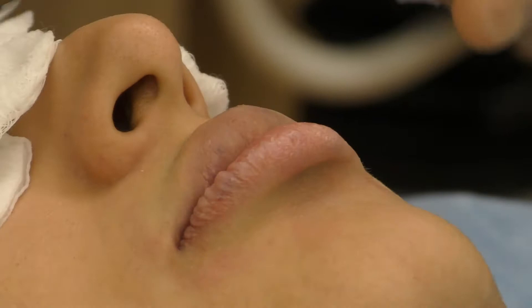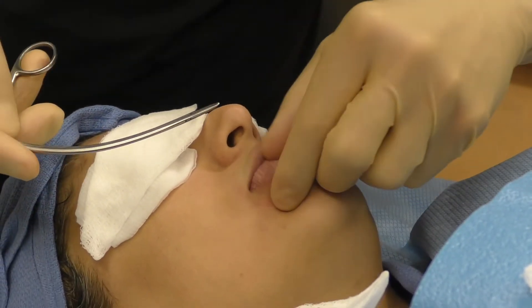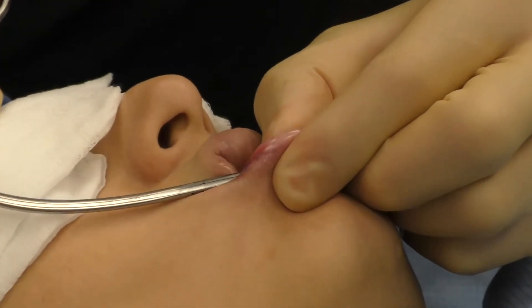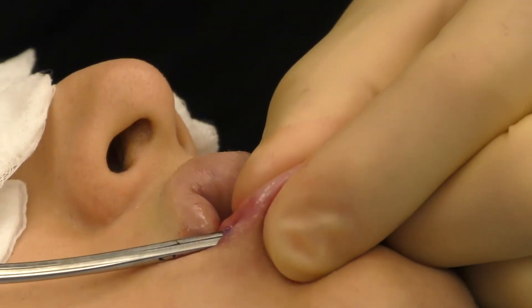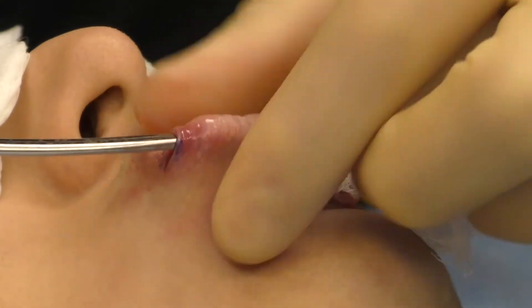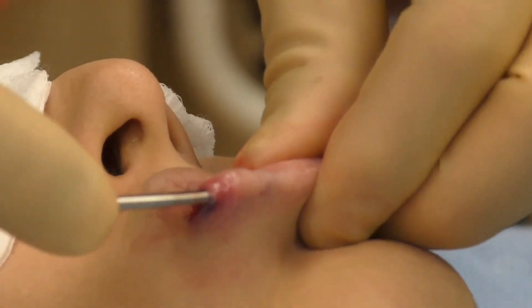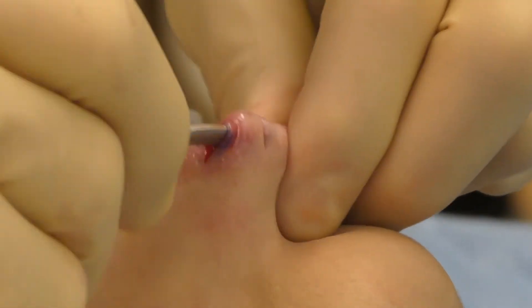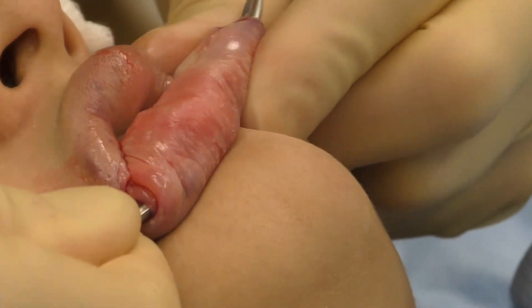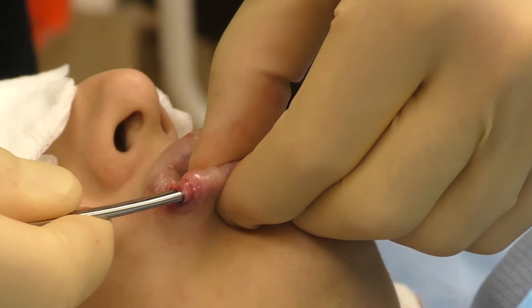I've done the dissection on both sides. This is the instrument we're actually going to place it with. It's curved — kind of really perfectly for the lips. It's not actually made for this, but we've adapted it for the use. We'll put that here where the dissection is. Sometimes it's going to be a little tough to get it started, but once we do, there we go. You can see we're almost there — and there we are to the other side. We've got that tunnel all the way through the lips. I know it looks a little brutal, but it's just the way it has to be done. That tunnel is made all the way through.